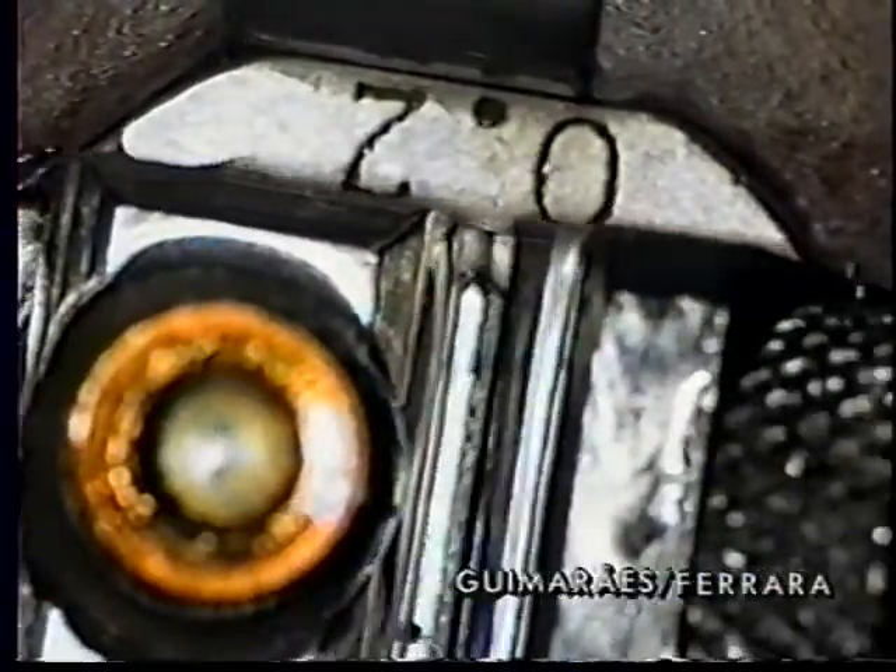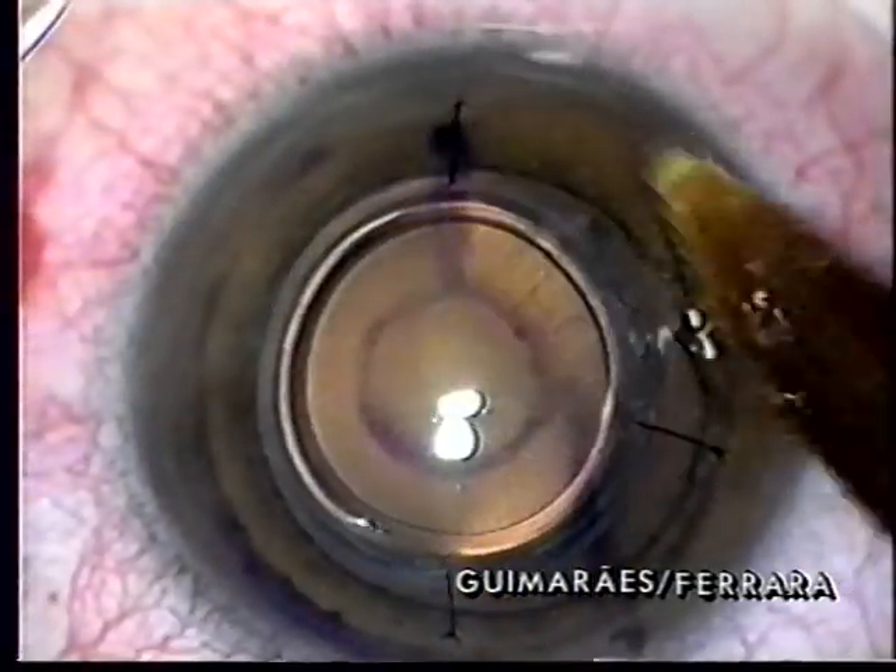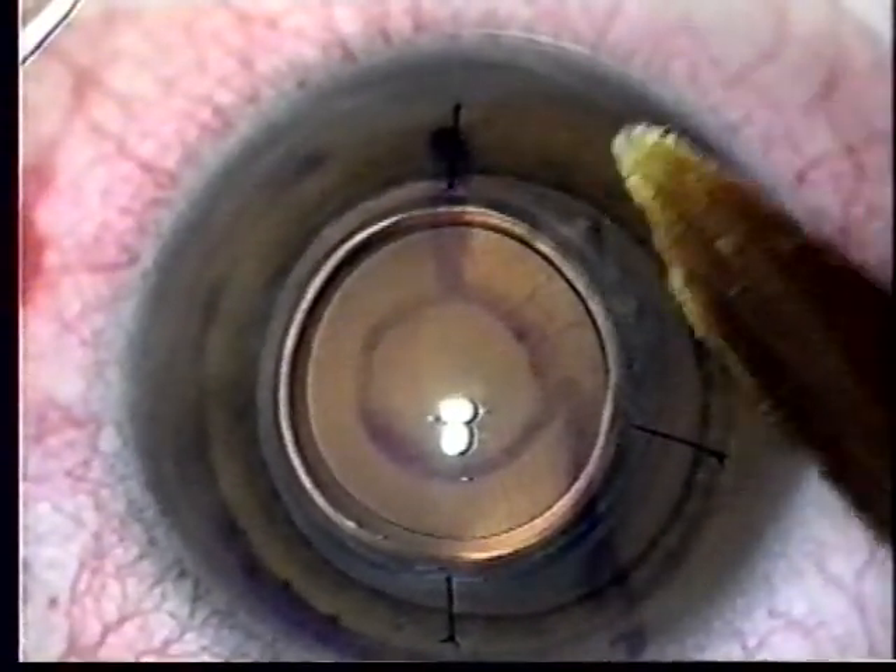Long-term animal experiments showed implant biocompatibility. In 1991, we implanted the first such ring in a myopic human patient with amblyopia and anisometropia, using partial keratectomy with microkeratome.